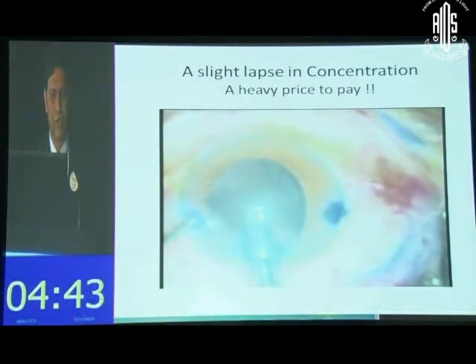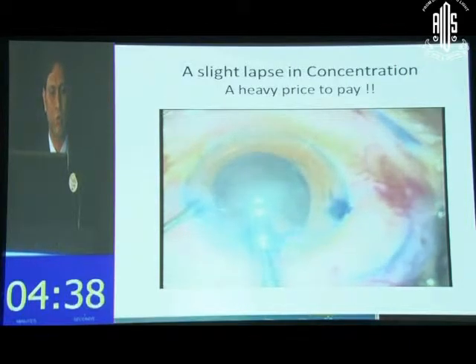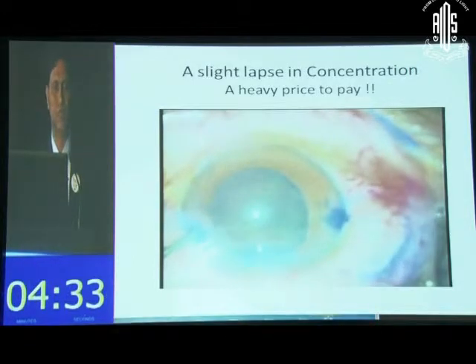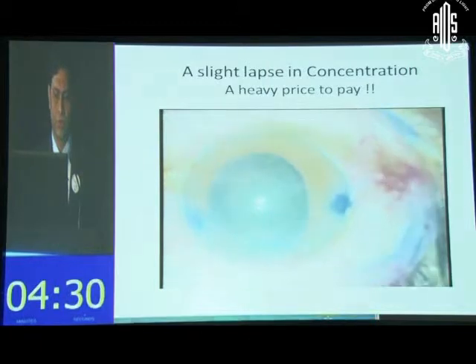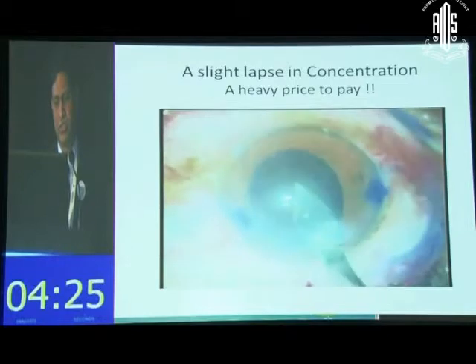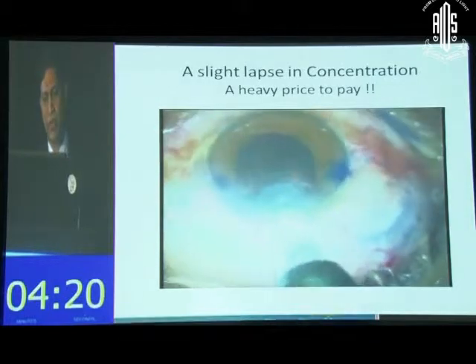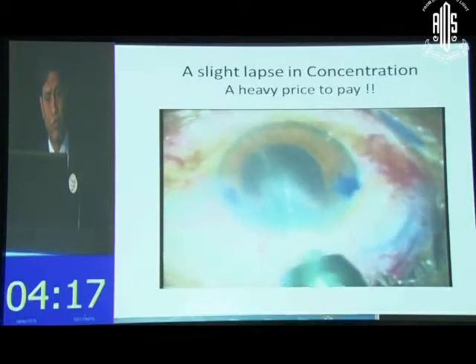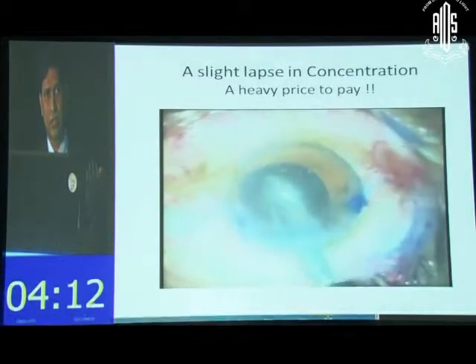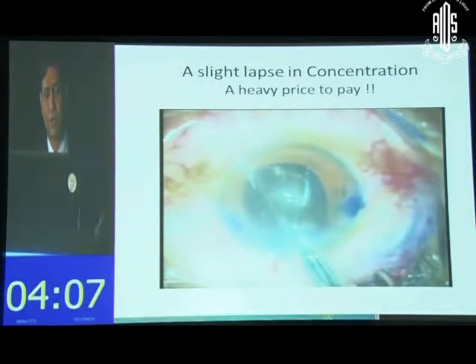Now, so far it's all right. Now I'm injecting viscoelastic because I know that my anterior chamber is going to collapse the moment I take out my probe, because that wound is going to just fish mouth like that. It just pouts, and everything that you put into the anterior chamber comes out. Anyway, this is at the end. While I'm doing the IOL, I just had to extend it a little bit to put in the IOL safely. So I'm using a multi-piece IOL over here, and this went off well. I put the IOL in the sulcus, and I had a very well-centered lens. There was nothing wrong with the rhexis tear, but I had a terrible wound burn.